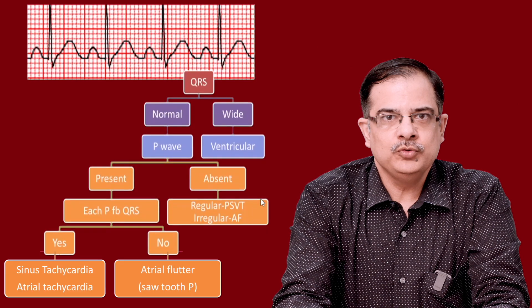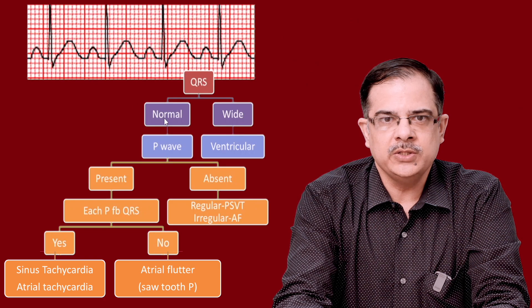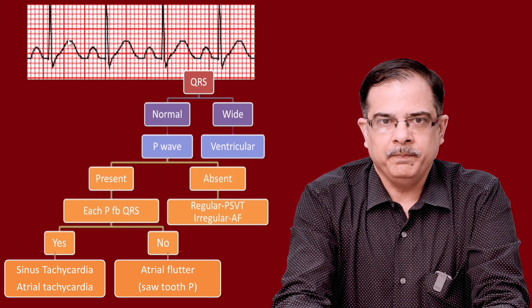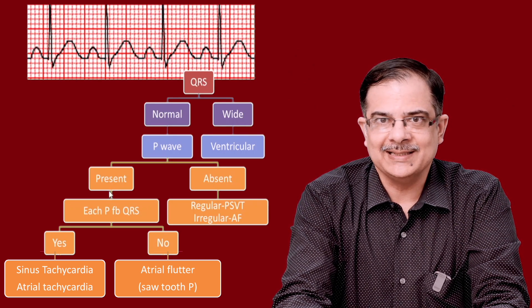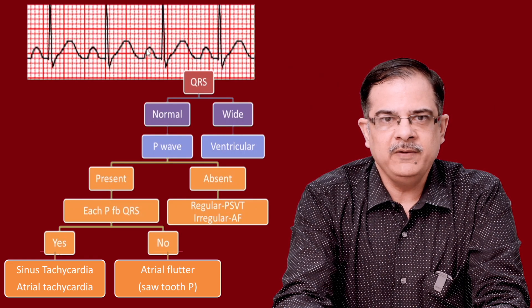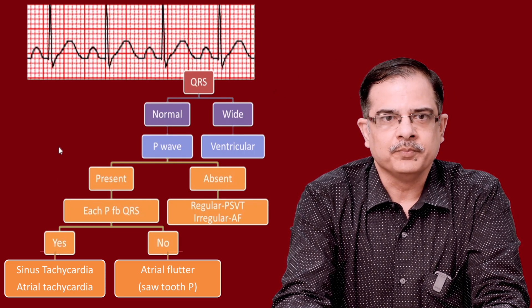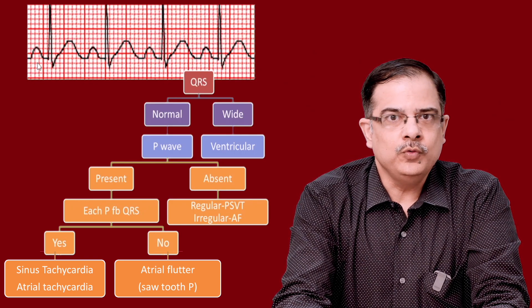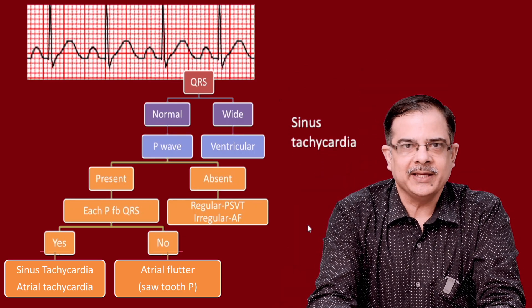First tachyarrhythmia example: RR interval is less than 15 mm — tachyarrhythmia confirmed. Step one: QRS complex is 2 mm — normal. Step two: P waves are present. Step three: each P is followed by QRS — yes. It could be sinus tachycardia or atrial tachycardia. Assuming lead two, the P wave is positive and consistent throughout the ECG. Therefore the diagnosis is sinus tachycardia.